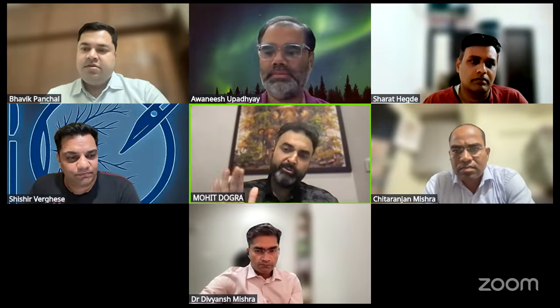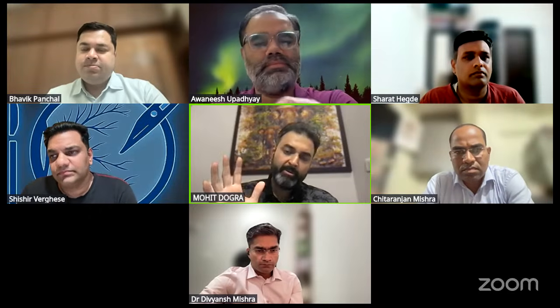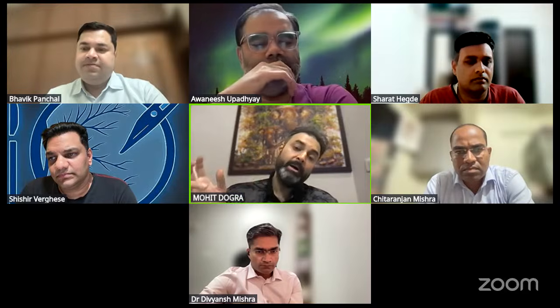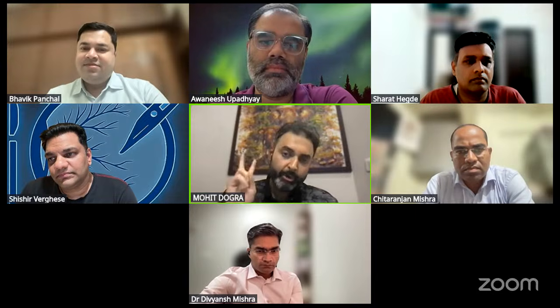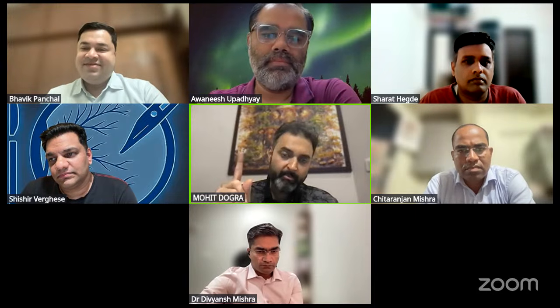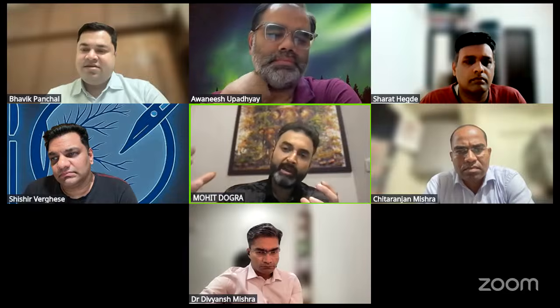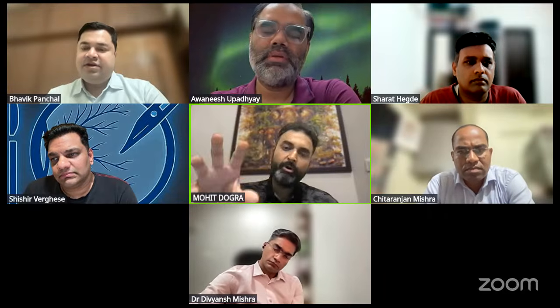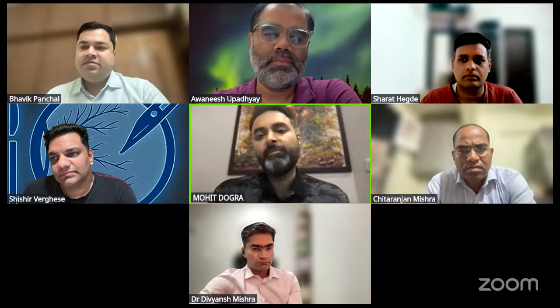Dr. Mohit? Up to 600 microns, conventional ILM peel and gas, face down. 600 to 1100 or 1200, I'll do a multi-layered ILM flap. I will not operate anything above 1200 except under two conditions: an eye with retinal detachment, or a myope with a large hole of any size, because I know that can be a cause for other things. Otherwise, I am not operating anything over 1200.